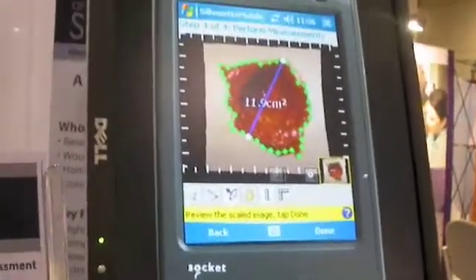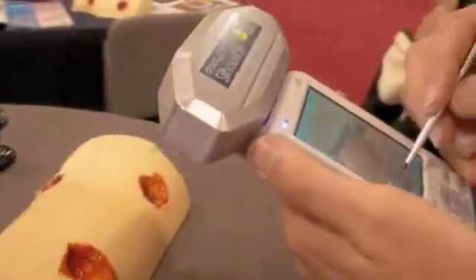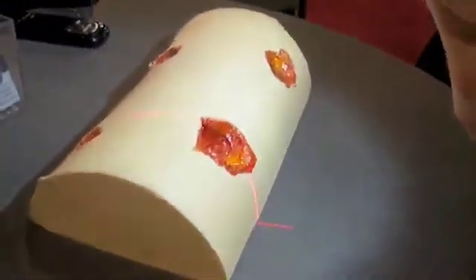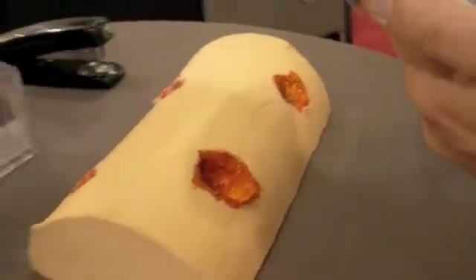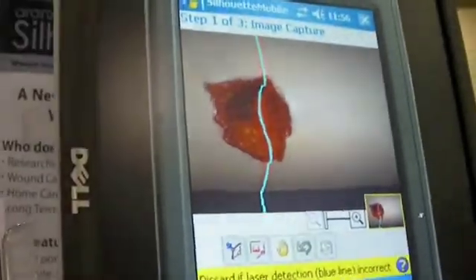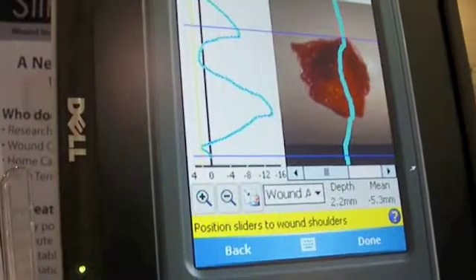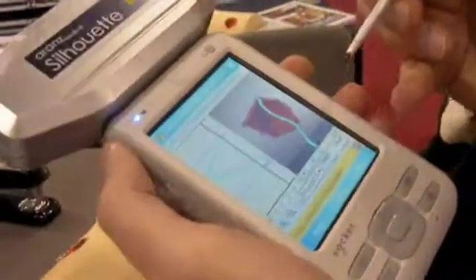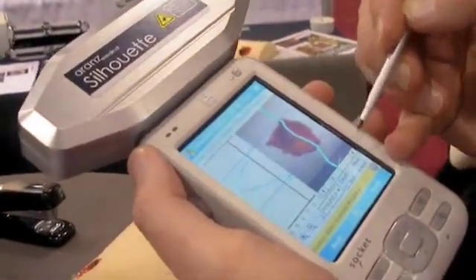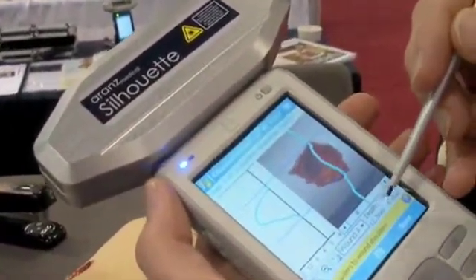For calculating depth, we do it as a second step. There's a single laser line which we cast through the deepest point of the wound. I tap on the screen to capture the image. For the depth, we do not draw around the wound, but we drag these sliders to the shoulder points of the wound. We thereby obtain a profile through the wound and calculate the maximum depth and the average depth.